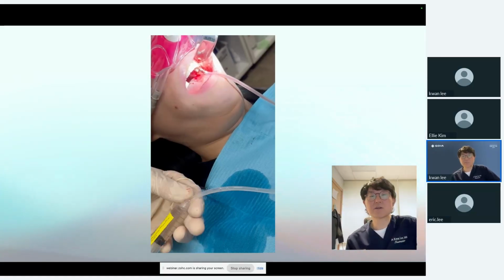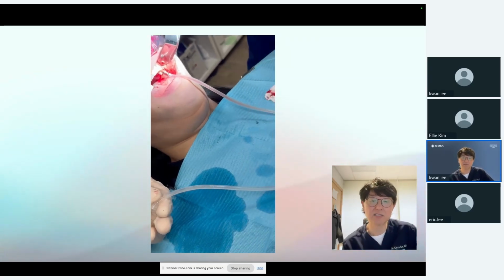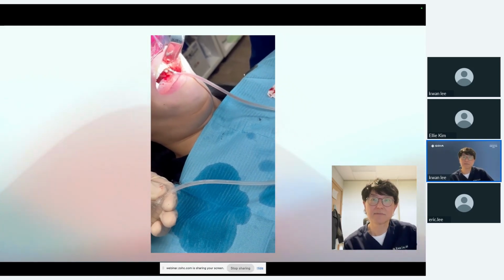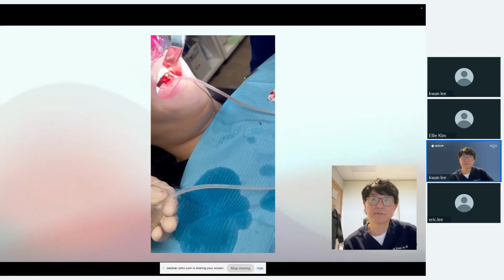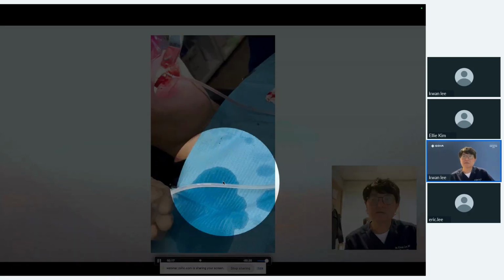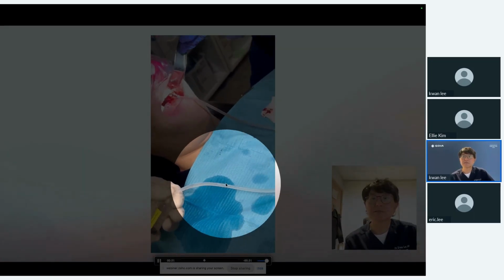Once the closed chamber is established, then you are using this syringe. So as long as the bubbles go in and out, then we are connected to the enclosed system inside our sinus. Bubble up and down, up and down. So look at this syringe.